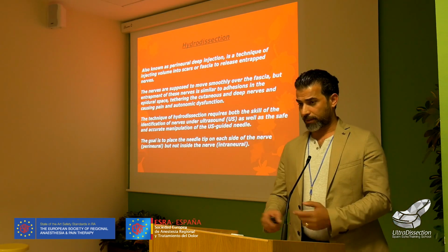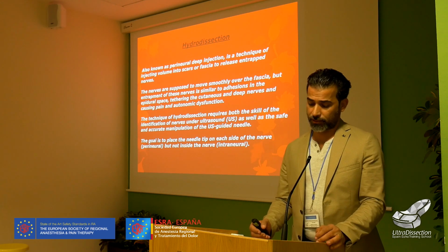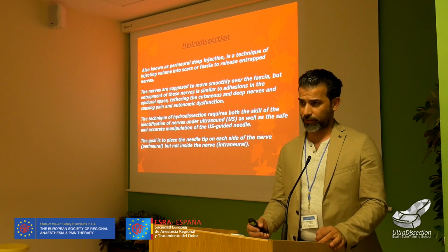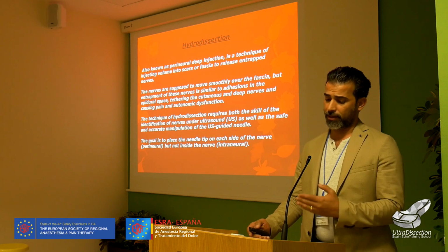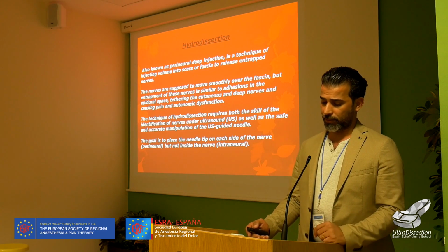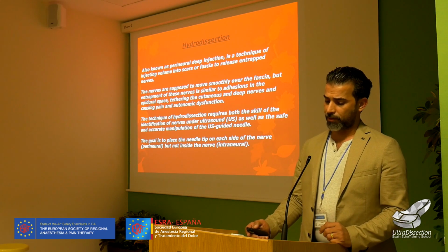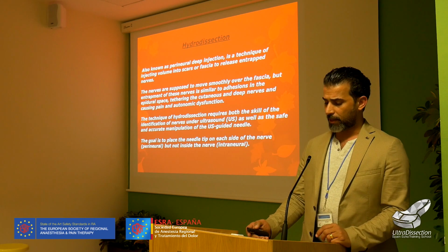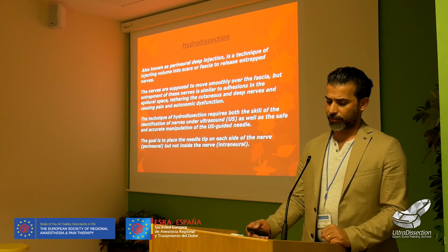So the topic of today's lecture is hydrodissection. What is hydrodissection? That was the introduction on the nerve and the mechanism of nerve injury and trauma. Now we start to define hydrodissection, which is also known as perineural deep injection. This is a technique of injecting volume into a scar or fascia to release entrapped nerves.